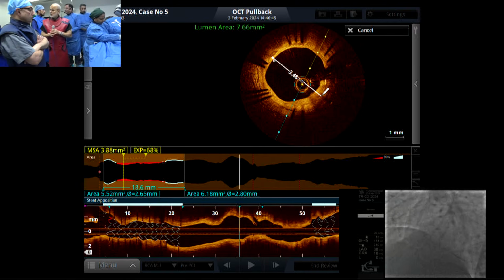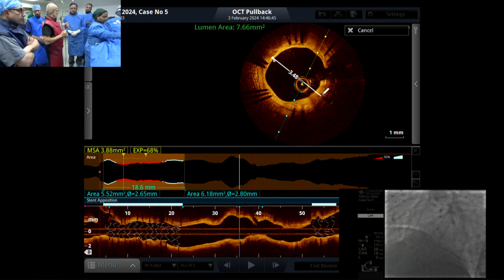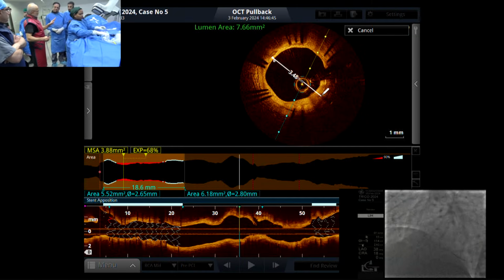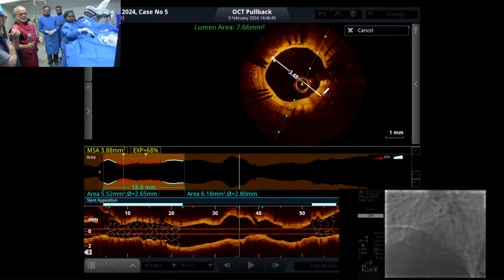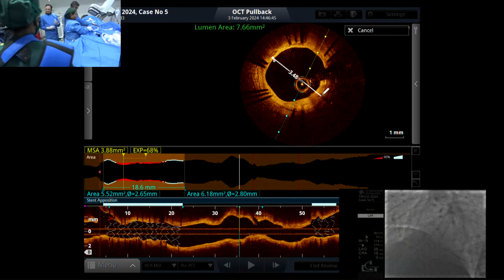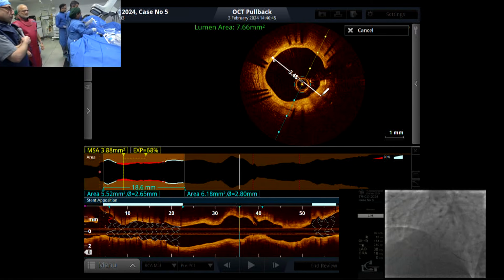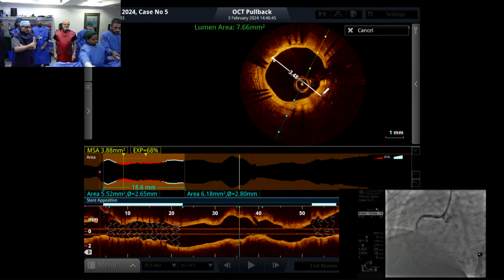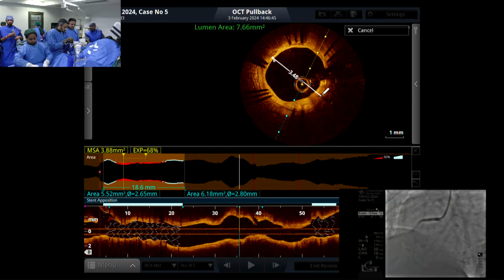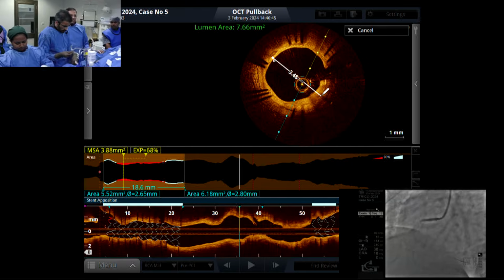Distal, 3 by 12... 3.10 Wolverine, yes. Take the Wolverine first. Then we will do the distal 3 to 5, and then we'll do another OCT, right? Good. So we're going to use the cutting balloon for the in-stent restenosis. Our goal or plan is to not stent, because there is a segment with 2 layers of stent.